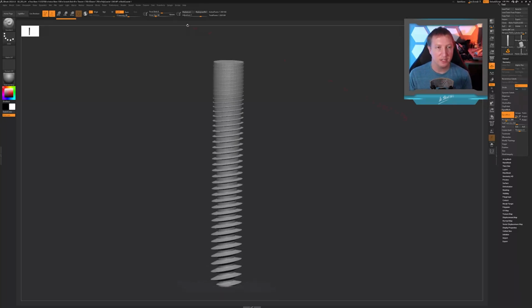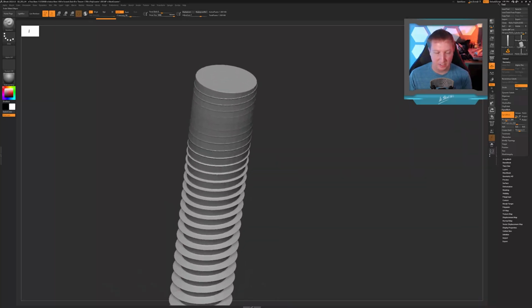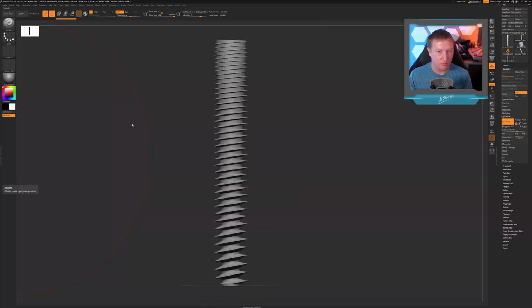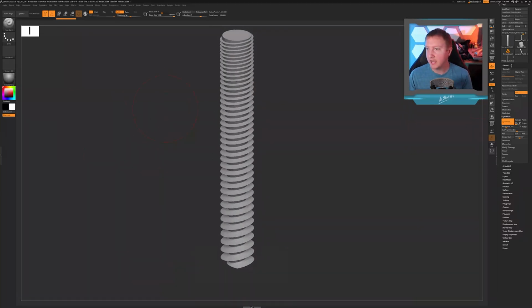All right, so now I'm just going to smooth this out a little bit. I'm going to decrease the size of this whole model so I can smooth this out, and increase my brush size. Let's just smooth this down a little ways here. And you know what I just realized is these threads up here are barely showing, so let's jump back here and fix that. All right, there we go, that looks better. So now let's go ahead and add our cannula.